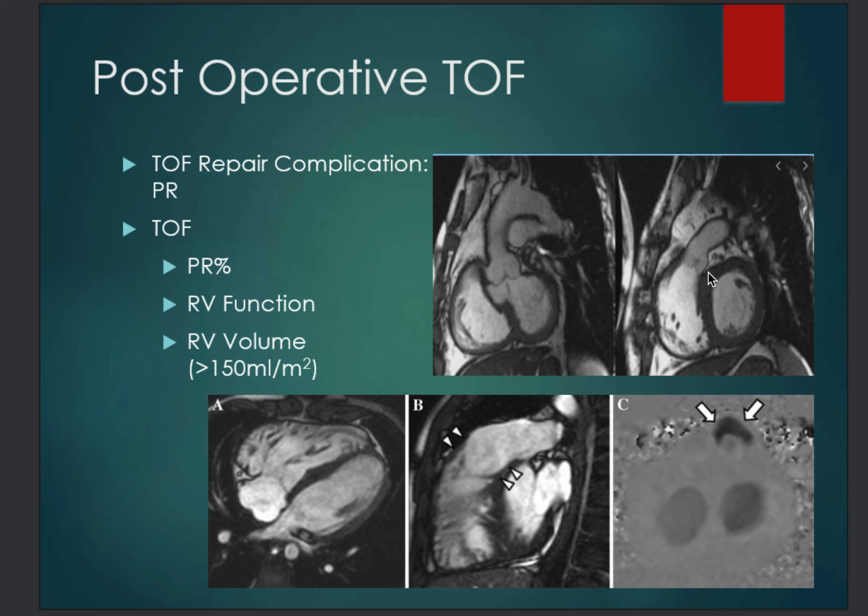Now there is a new stent in the market called Venus, and I think it's larger than the Sapien. I'm not sure about the number. It might be 30 or 31 is the largest diameter for the Venus stent at the moment. But again, so far this is still not heavily discussed in the market. So the Sapien 29.